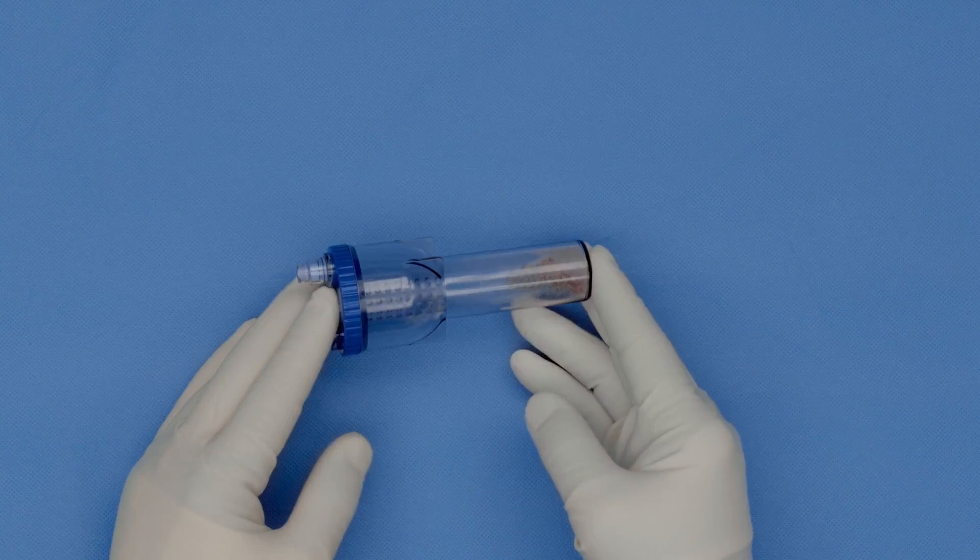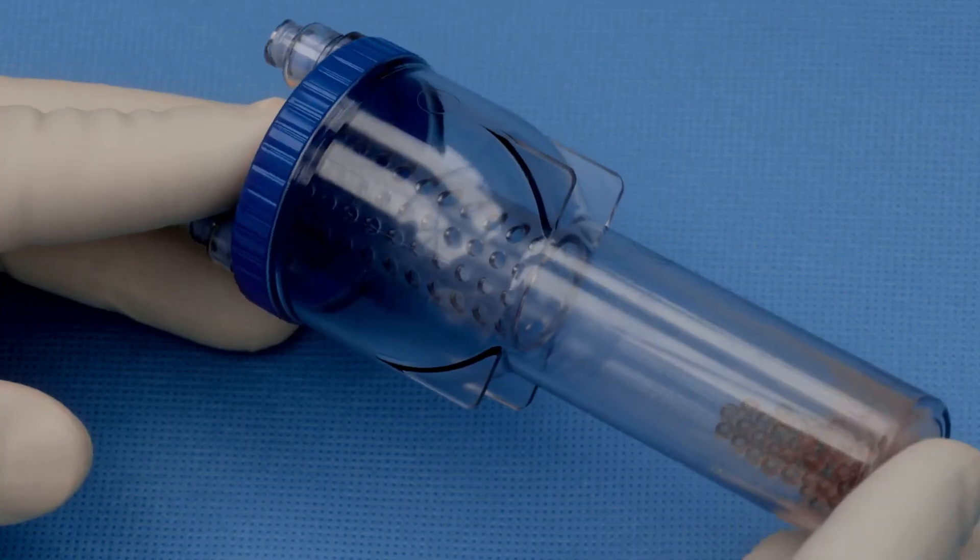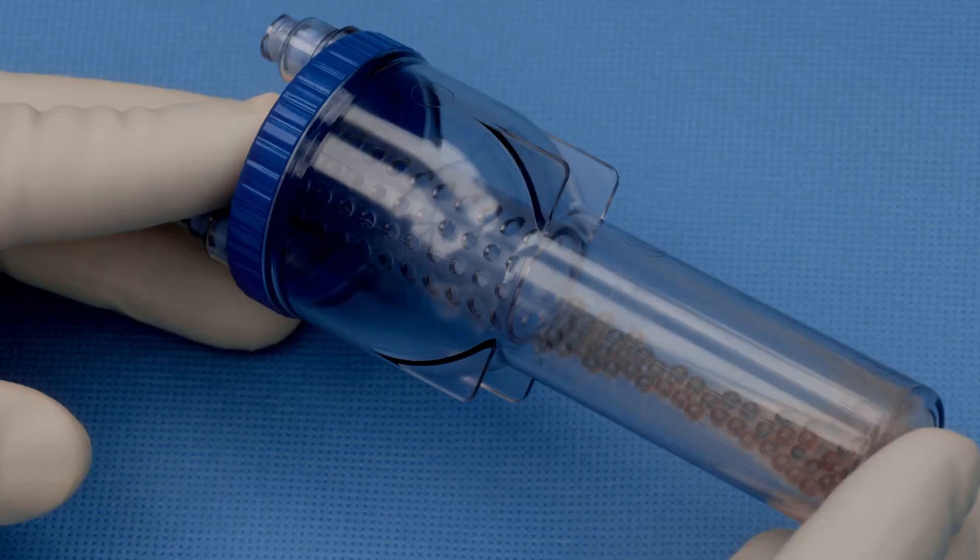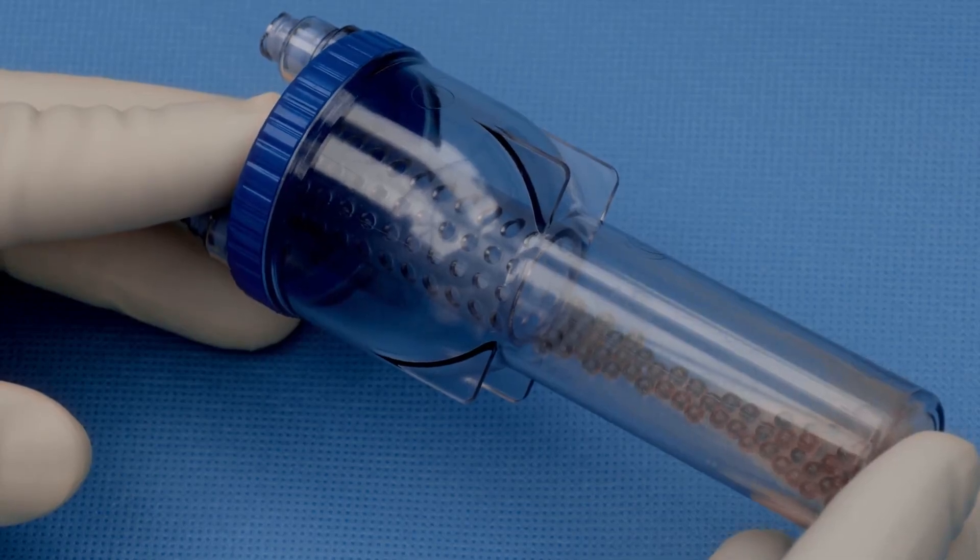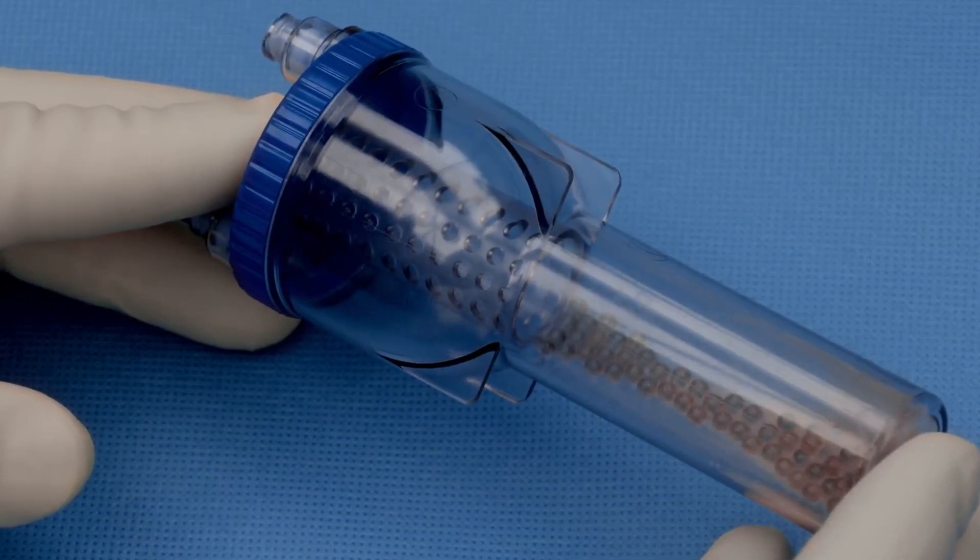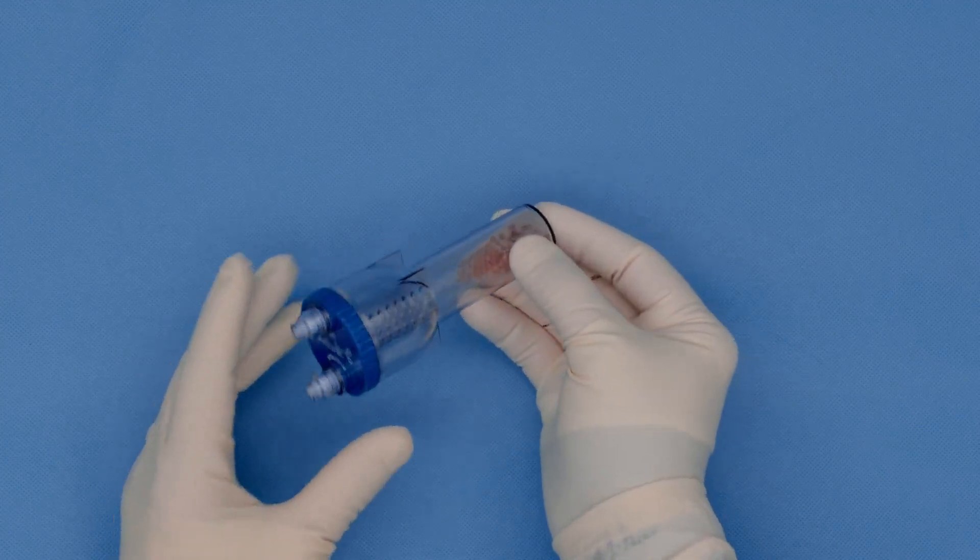The thrombinator device is a closed system that has glass beads inside and with the help of these glass beads it is very easy and convenient to produce autologous thrombin out of ACP.